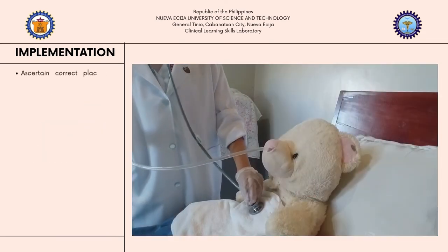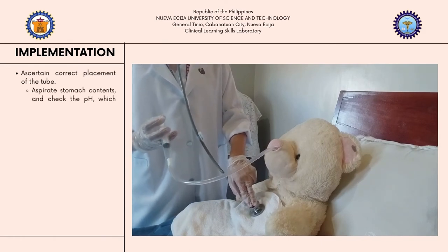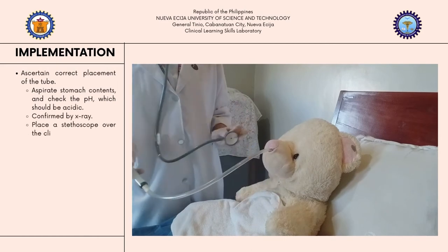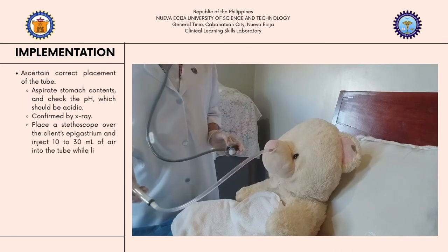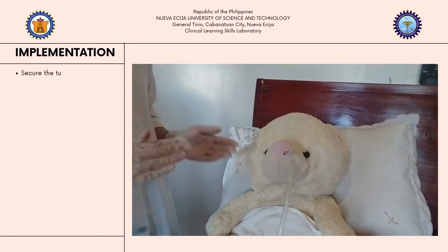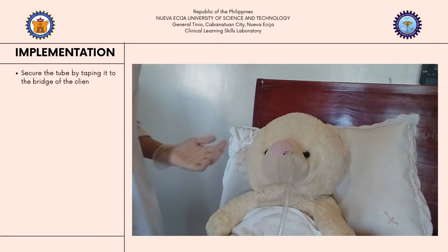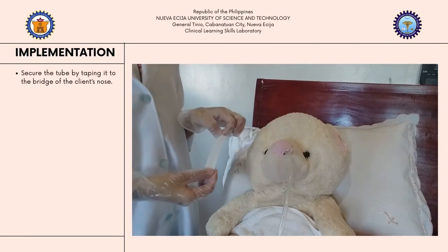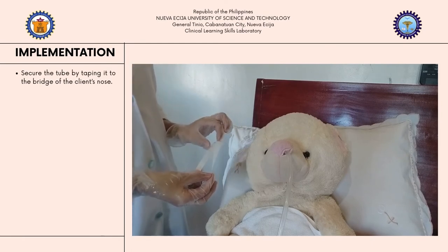Place a stethoscope over the client's epigastrium and inject 10 to 30 ml of air into the tube while listening for a whooshing sound. Another method that we can use is confirmation using an x-ray. Then, we need to secure the tube by taping it to the bridge of the client's nose using a commercial securement device or a non-allergenic tape that is 3 inches in length and has been split in one end, with a 1 inch tab at the other end.